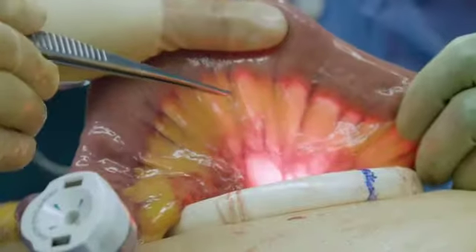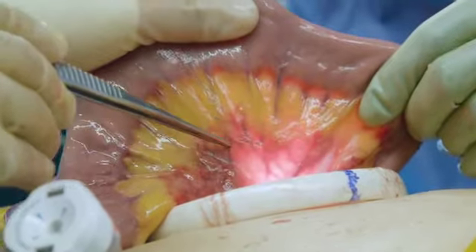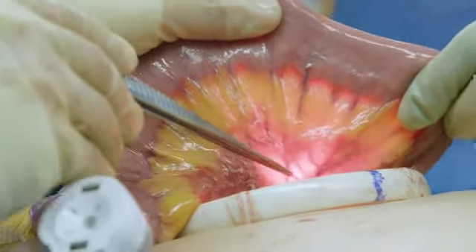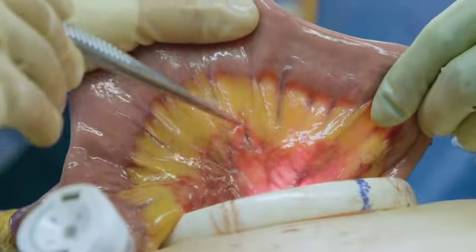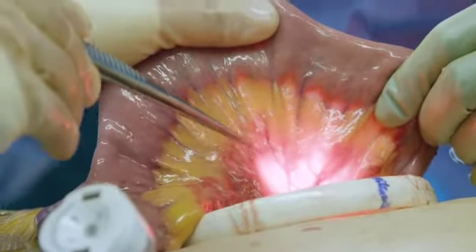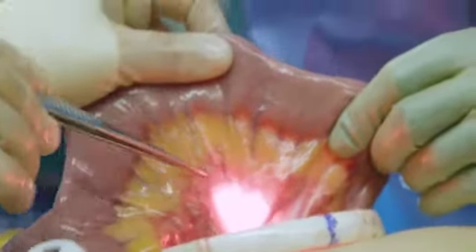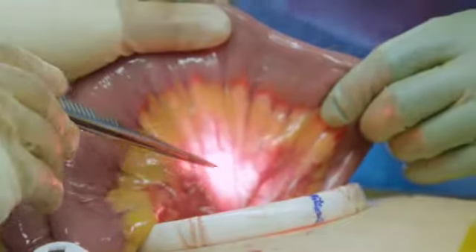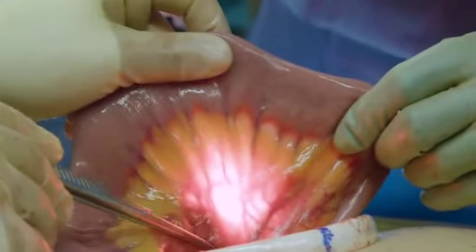So you can see the vessels here. This is the arcade that we were talking about on the picture before. Larger vessels here, you can see they're all intact, not disrupted. This area here is where all the fat extraction has already occurred on both sides. And you can see these blood vessels running up to the small bowel. That's what's feeding all of it to keep it healthy and alive. And these are the areas here where we really extracted the majority of the visceral fat.